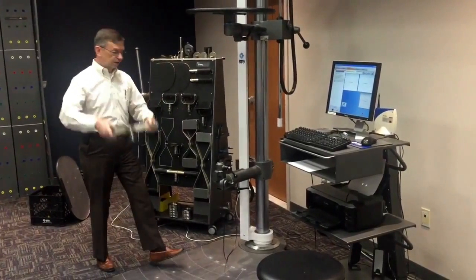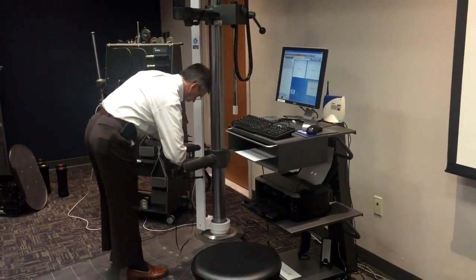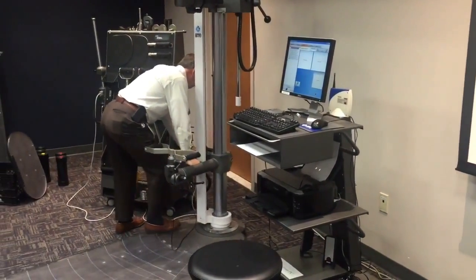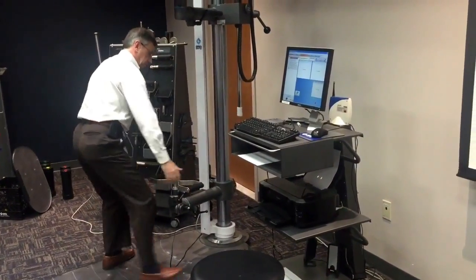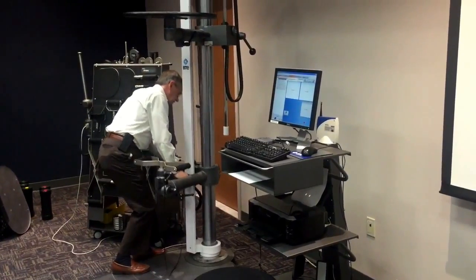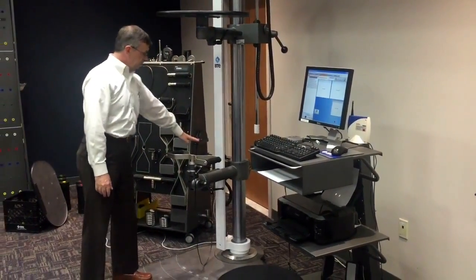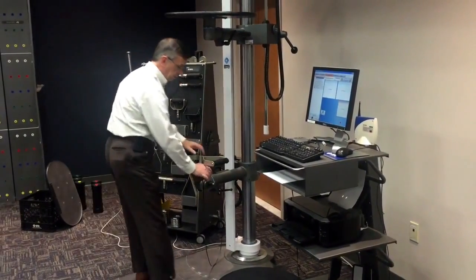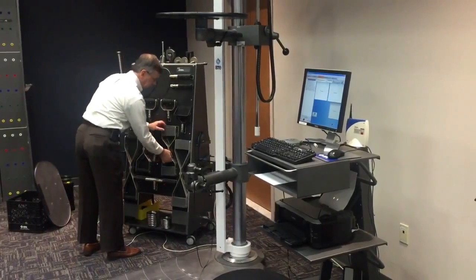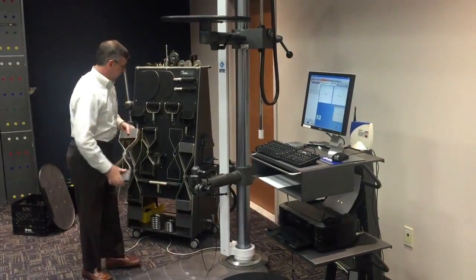Or if we want a double handle lift, that can be placed in here as well — locked into place, adjust the height, so if we want somebody lifting from low or anywhere in between. Pretty easy to adjust, lock into place. There's a height recording over here. Even the height is recorded in the software for reproducibility purposes. If we want to use handles that are a little flatter, more like lifting a box, we can switch to those.